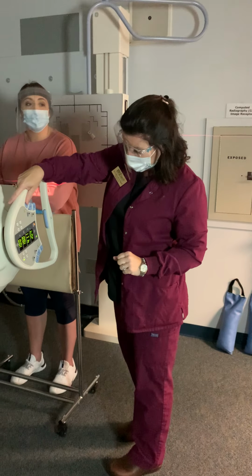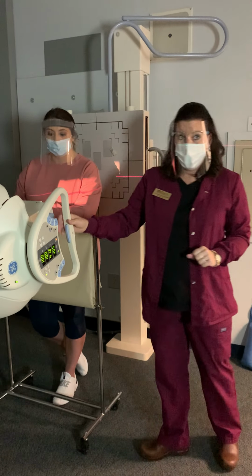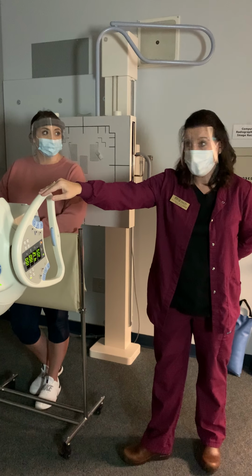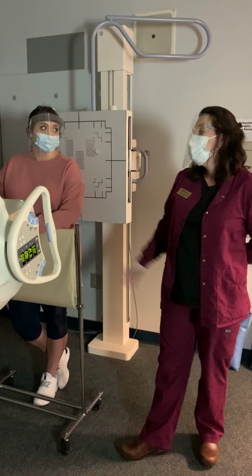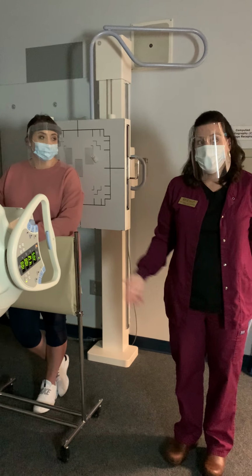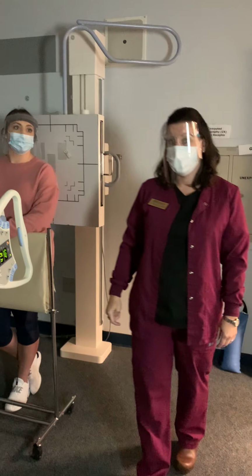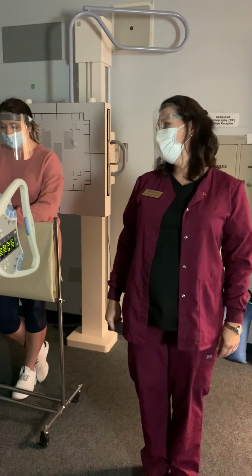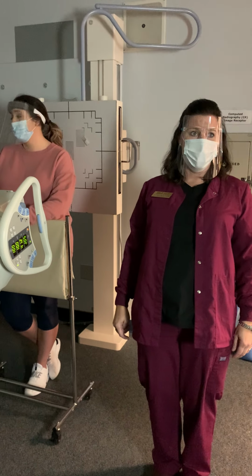It's gonna be an angle. Axial means angled. We can either angle the tube, or I could angle the patient, or I could angle both. But with this, their book does show you that you can do lordotic. Y'all remember lordotic? Patient takes a step forward and then leans back up against the IR. That's just dangerous. That's a hard position for a patient to hold.